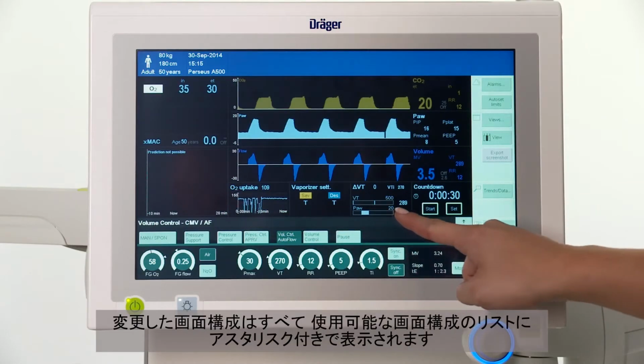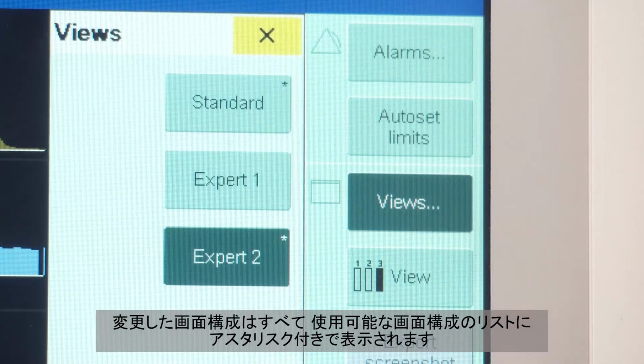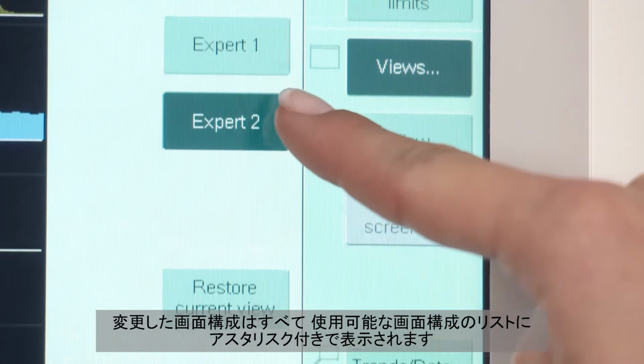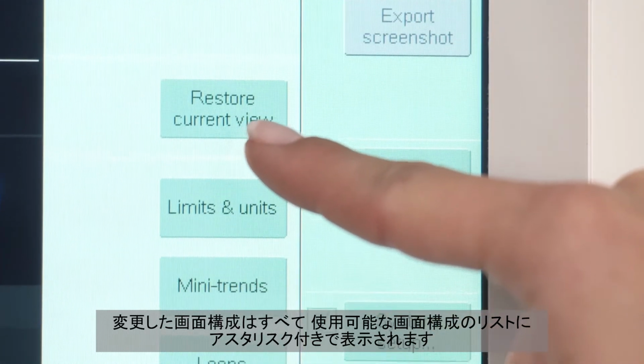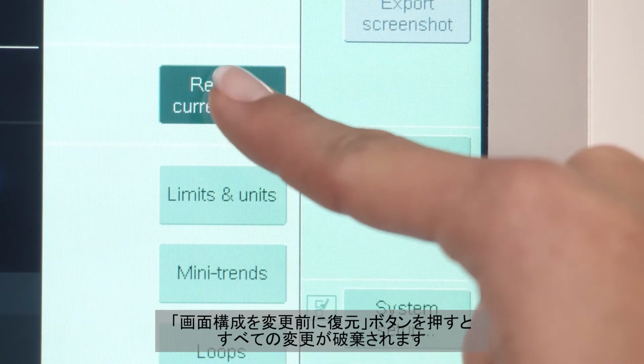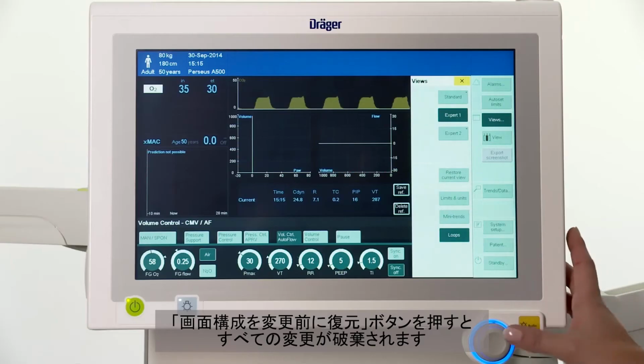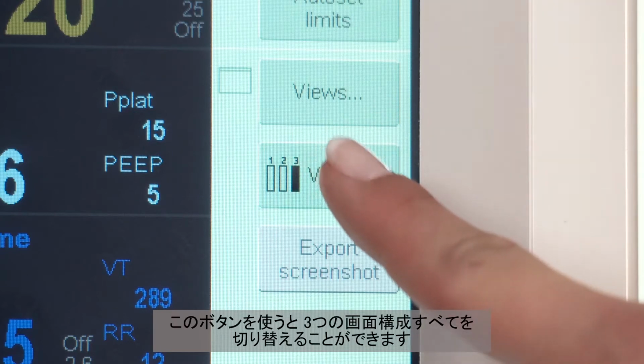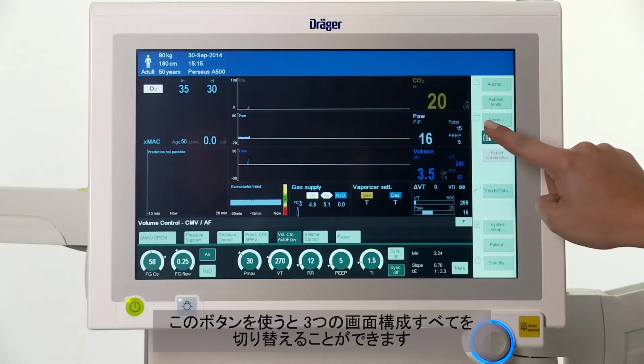All modified views are marked with an asterisk in the list of available views. Pressing the Restore Current View button will discard all changes of the views. This button allows you to toggle between all 3 views.